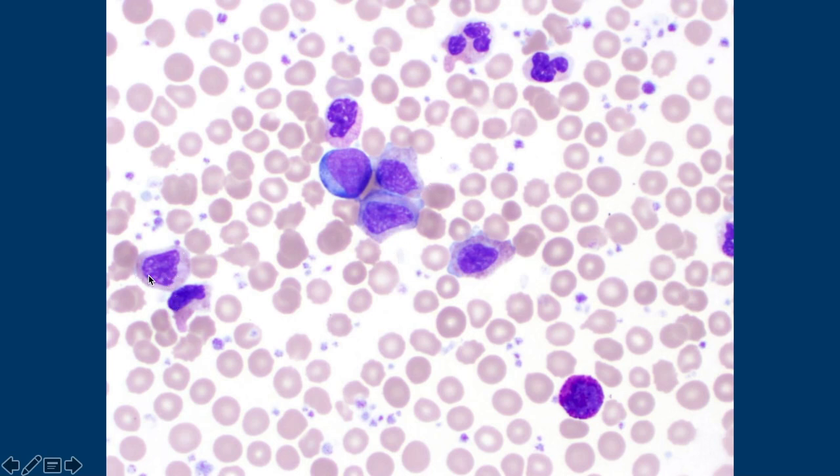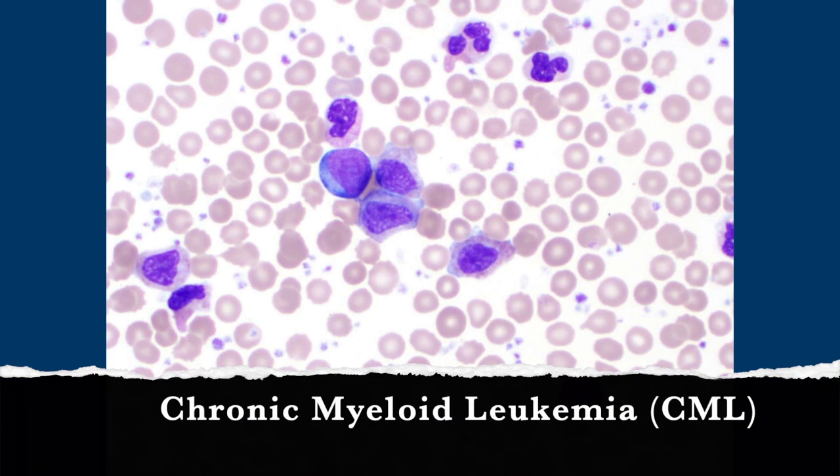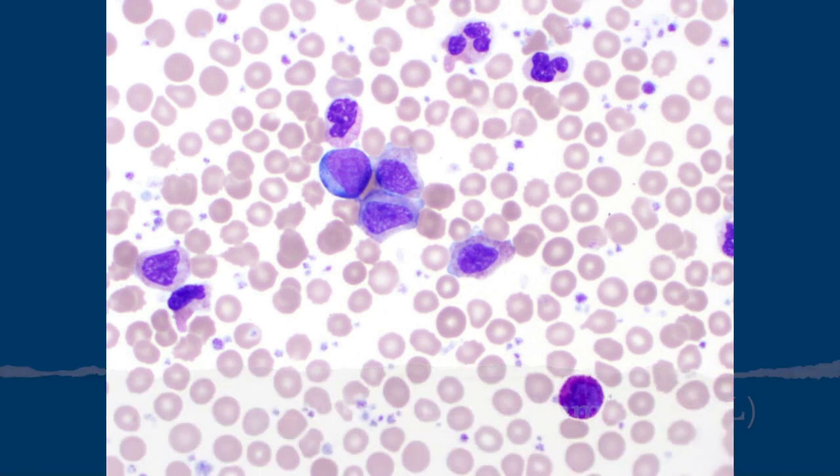Either a meta or a myelocyte — it's got that dawning of neutrophilia. And that's a blast. So they're all myeloid precursor cells at different stages. Does that mean this person has chronic myeloid leukemia? Yes — CML — because you get a range, you don't have enough blasts, but you have different levels of maturation. This ended up being chronic phase, so there were less than five percent total blasts.